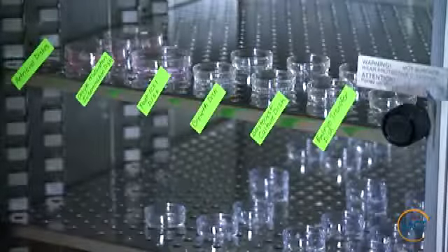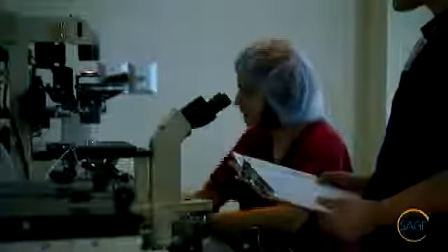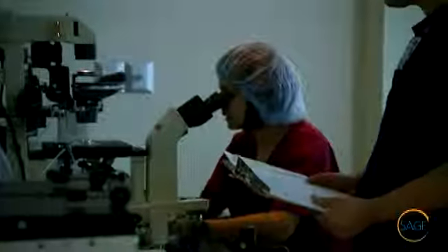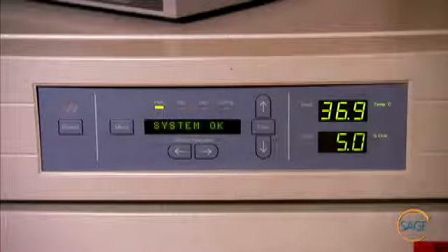Equilibration time should not exceed 18 hours, as the degradation of amino acids, protein sources, vitamins, and the antibiotics will begin. Limit embryo observations as a way to decrease incubator door openings and decrease embryo exposure to unnecessary changes in temperature or pH. Thermal control is one of the most important culture system variables in the IVF laboratory and requires close attention and management. Oocytes and embryos are particularly sensitive to alterations in temperature.